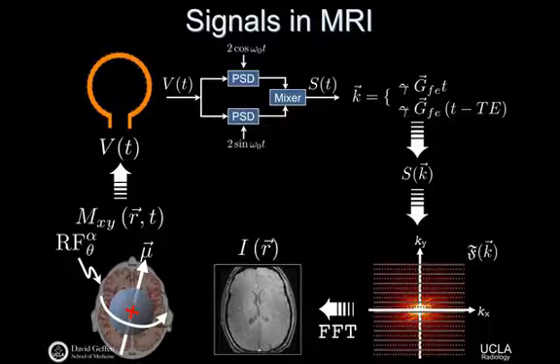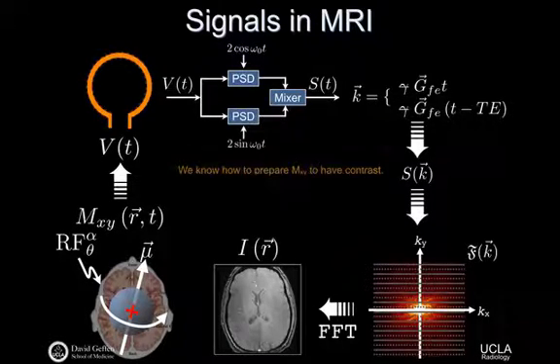And we'll have to get at a deeper and deeper understanding of why it is that it's the Fourier transform that operationally takes us from k-space back to image space, the thing that we really care about. And that's something we'll have to build apart today and then in some of the future lectures too.